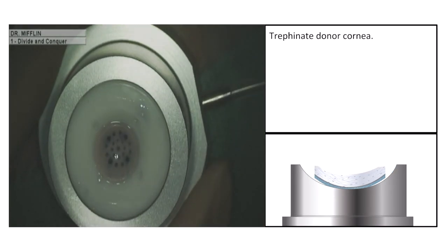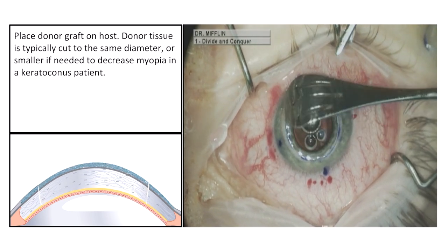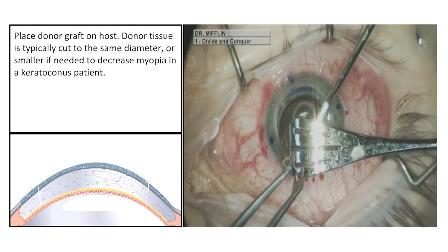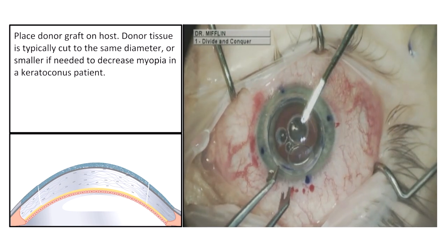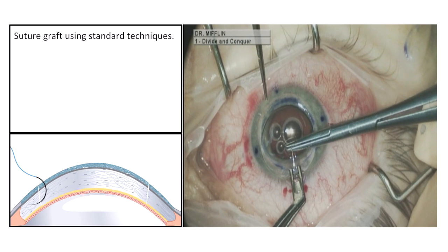Now focusing on the patient again, place the donor graft on the host. Donor tissue is typically cut to the same diameter, or smaller if needed, to decrease myopia in a keratoconus patient. Then suture the graft using standard techniques.